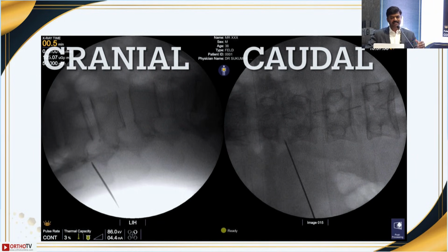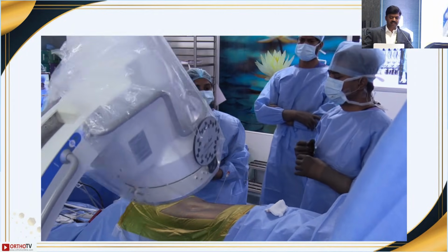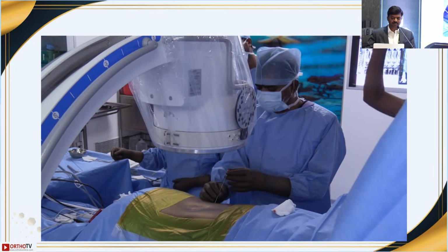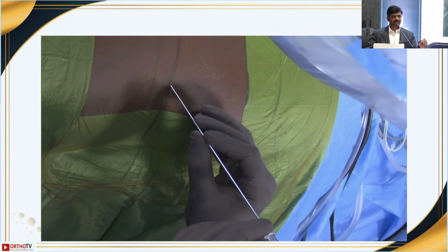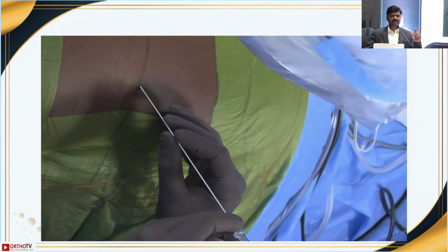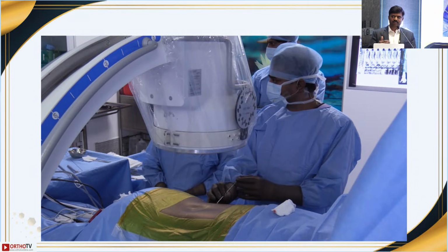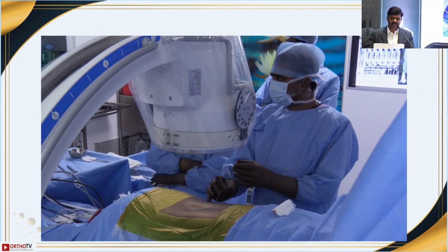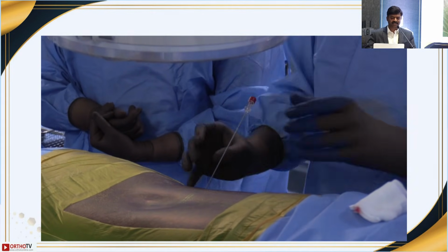In the lateral view, you understand whether you are cranial or caudal. Here we are directed more towards cranial, so we can adjust our needle again in AP. When you want to adjust, you come out. Don't try to manipulate in the same position because your needle will get bent. So you come out 5 centimeters, outside the fascia, then you can go in again so that your needle is not getting bent.